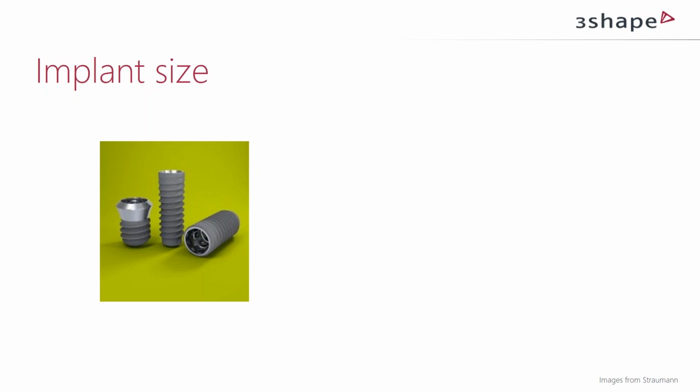Sometimes there is fashion in which implant to use, and sometimes we read something in an article and change our knowledge base. So the selection of implants can come from different places, and I will try to cover them all.